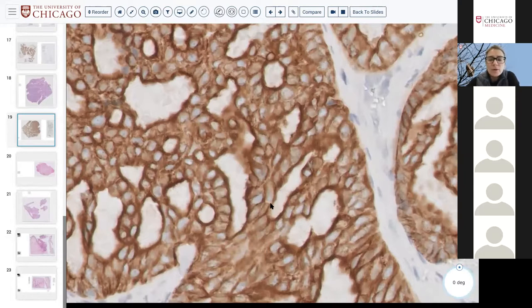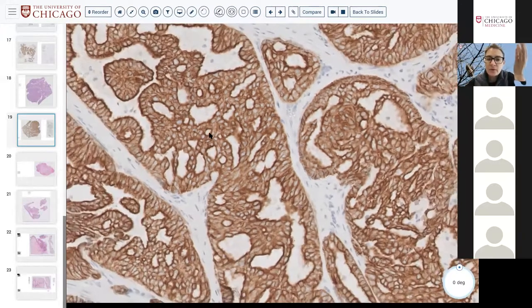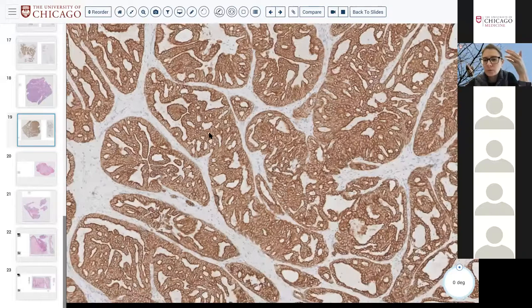All right, so when you have adenocarcinomas of the sinonasal cavity, you can get squames everywhere. We're used to seeing squames, right? So what happens when you see a glandular carcinoma? In the sinus, you want to think about a few of the more reasonably frequent ones, including the non-intestinal type, the intestinal type, and then just a random salivary gland carcinoma type, right?